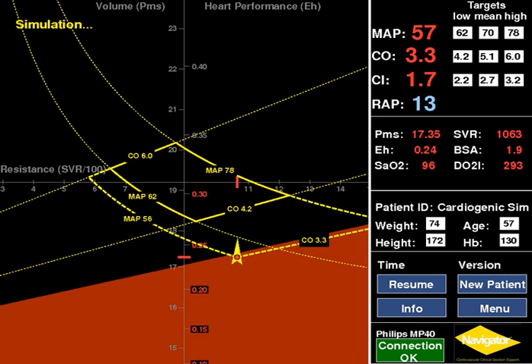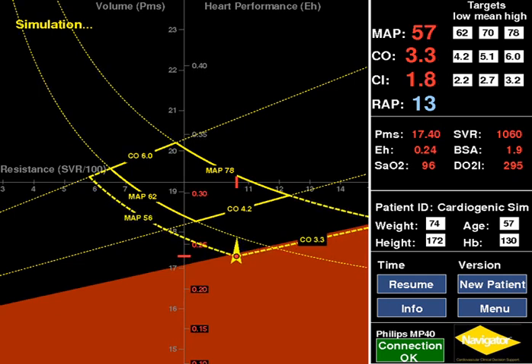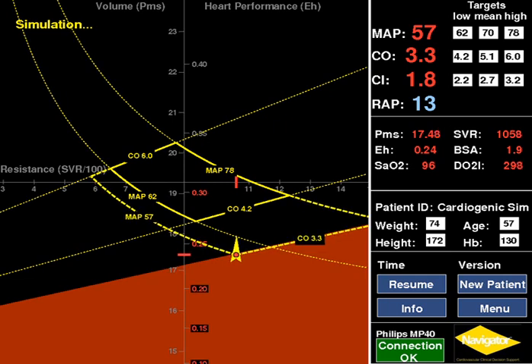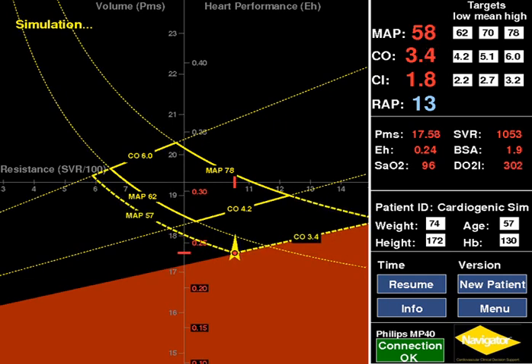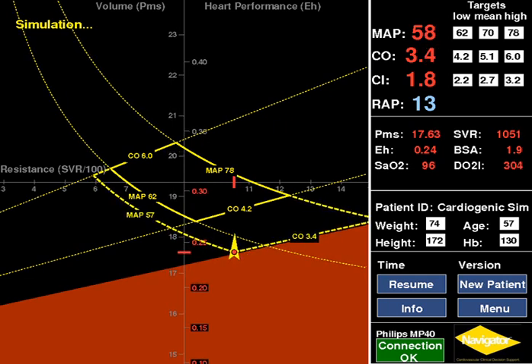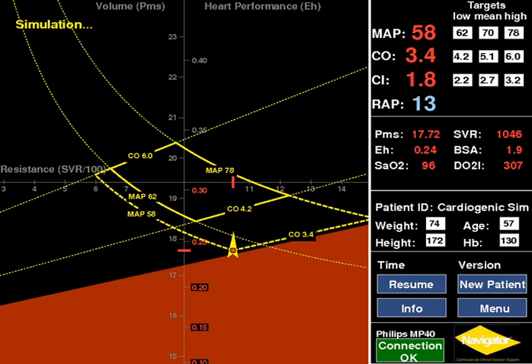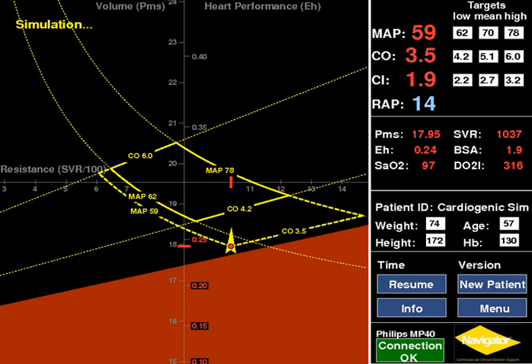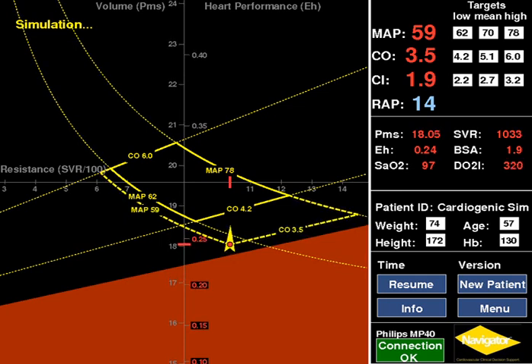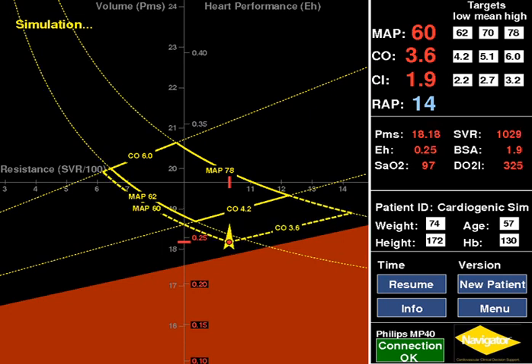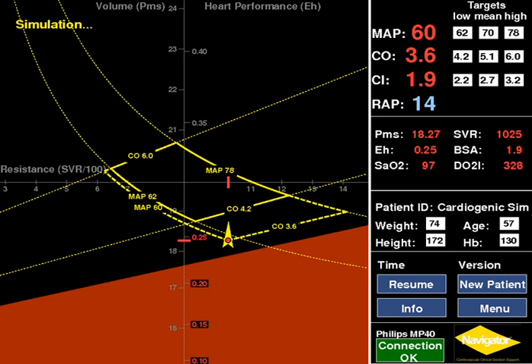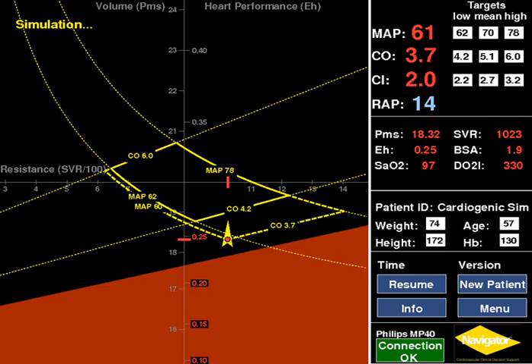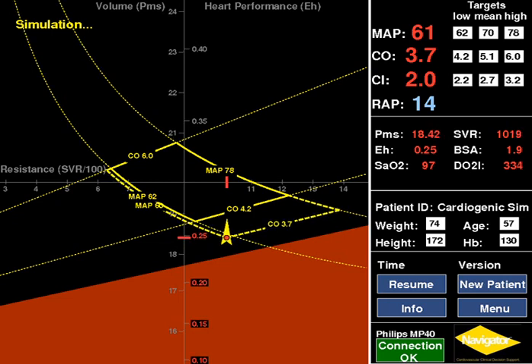In the situation of low cardiac performance, the clinician may affect upward movement by increasing the patient's volume state and/or cardiac performance. A fluid challenge is given to increase the patient's volume state. The patient status is seen moving upward in response to the fluid and the MAP increases to the low target range of 62, shown when the MAP broken line disappeared into the PTZ.